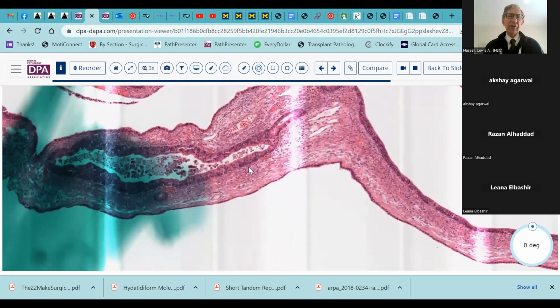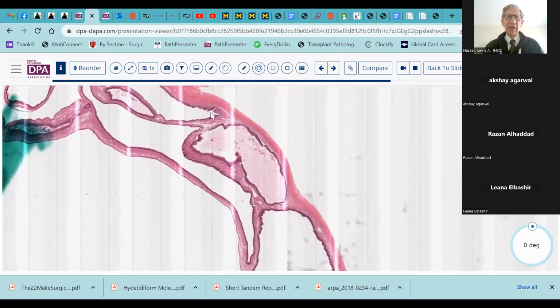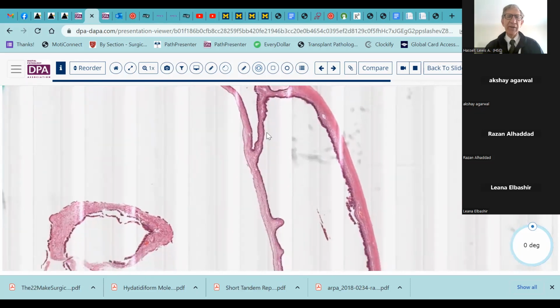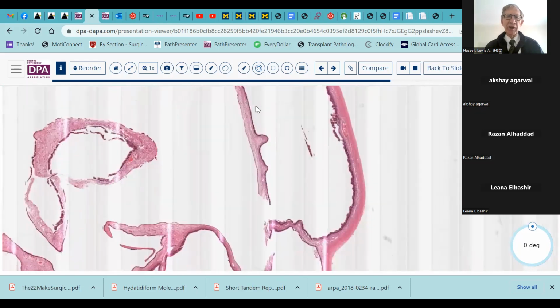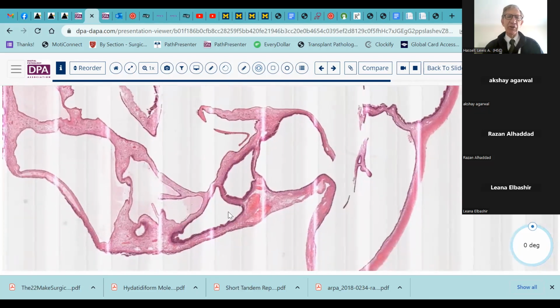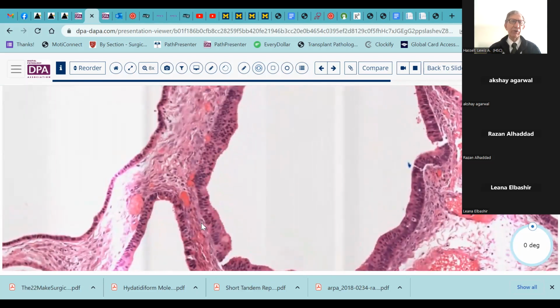And I think this underscores the fact that, although endometriosis is common and certainly can be present on the fallopian tube and other areas, it is a potentially pre-neoplastic disorder and sets us up for that. Now, should this be called an endometrioid adenofibroma or something of that sort? I suppose you could make that case because you do have a little bit of fibrous tissue in between these cystic spaces, which look truly endometrioid.